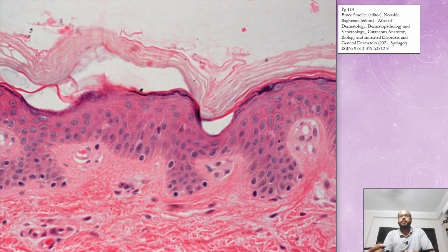So in the past few slides we have discussed the individual layers of the epidermis, and we'll just revise them. And here you can actually see the melanocytes very clearly. Can you see this is a melanocyte? This is a melanocyte. This is a melanocyte. Can you see the large round basophilic nuclei, a little bit of halo around it, vacuolated appearance, looks like an empty cell at the basal layer, isn't it?